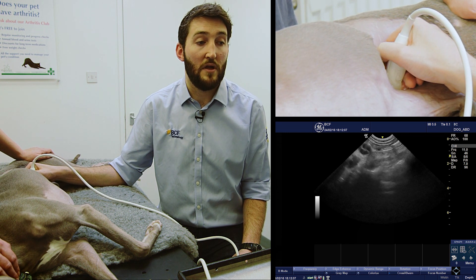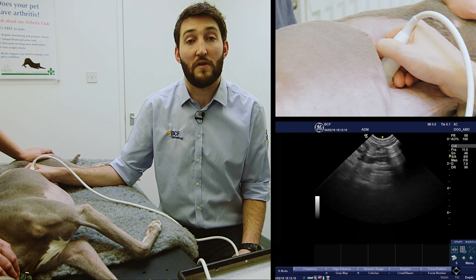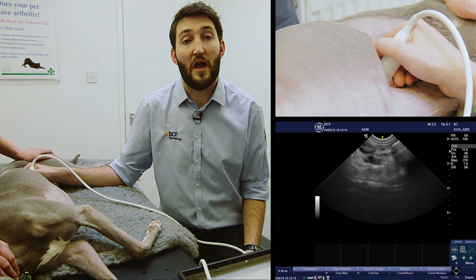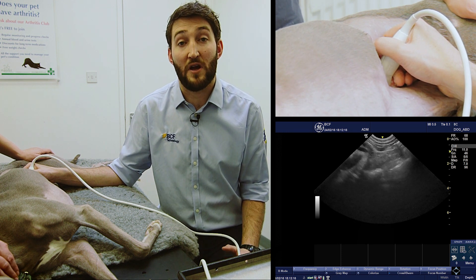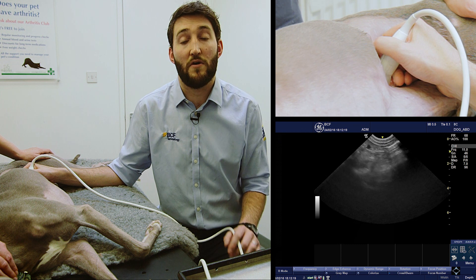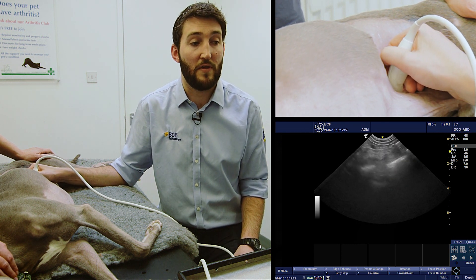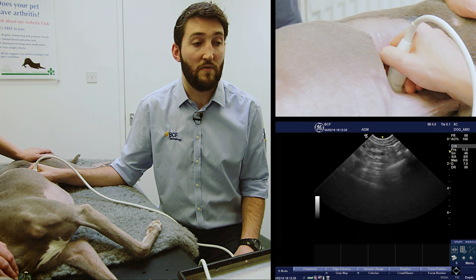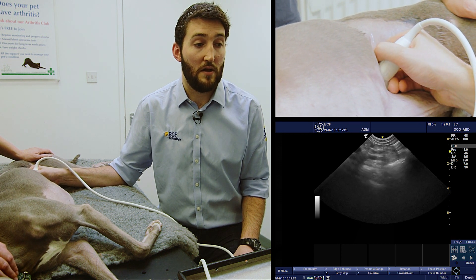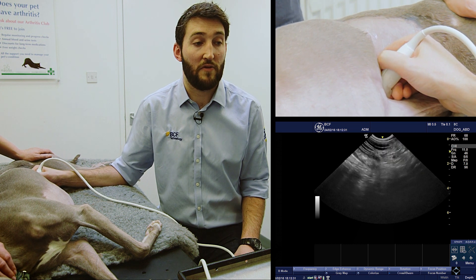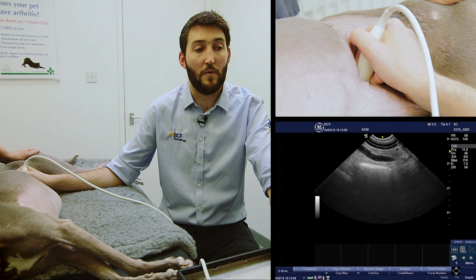We're hunting down a vessel, and what we're looking for when finding the lymph nodes is an elongated or fusiform structure lying parallel to the blood vessel, usually along either side of it, with similar echogenicity to the surrounding mesentery. If you have an overweight dog or there is a lot of intestinal gas, it can be quite difficult to locate these structures — and you can see in this dog there's a little intestinal gas getting in the way.